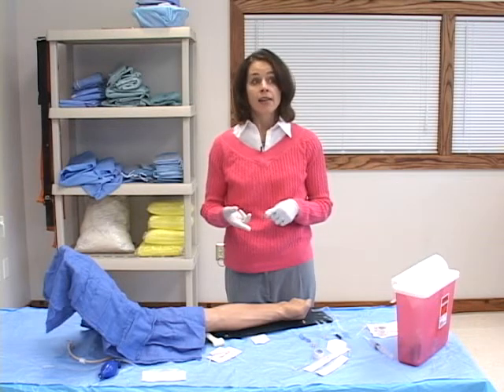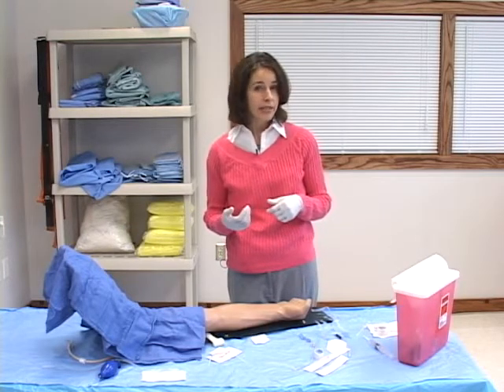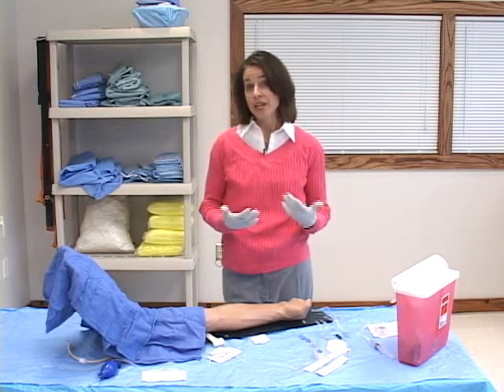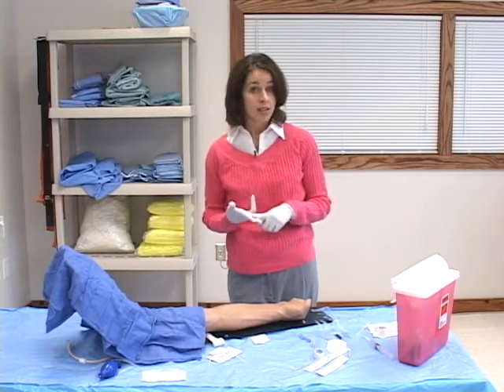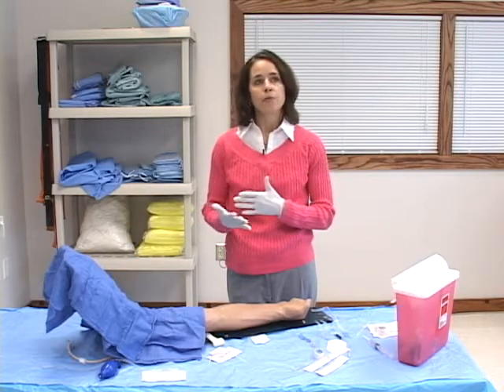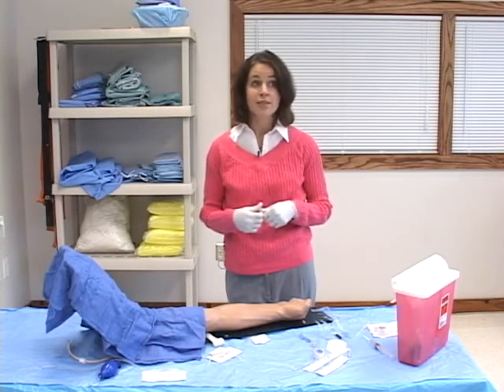So you're able to pick out a proper spot. The other thing you need to keep in mind is that often because of the developmental level of the child or their cognitive skill, they are unable to comprehend why we need to start an IV, and they're unable to recognize the importance of staying still and being calm. So this is when it helps to have parents in the room. They can often help calm the child, and one of the child life specialists may be able to read to the child or distract them with bubbles or something like that. So you want to use all resources that you can to make this as calming and comforting as it can be for a child, because most children are scared of needles, and a few adults are as well.